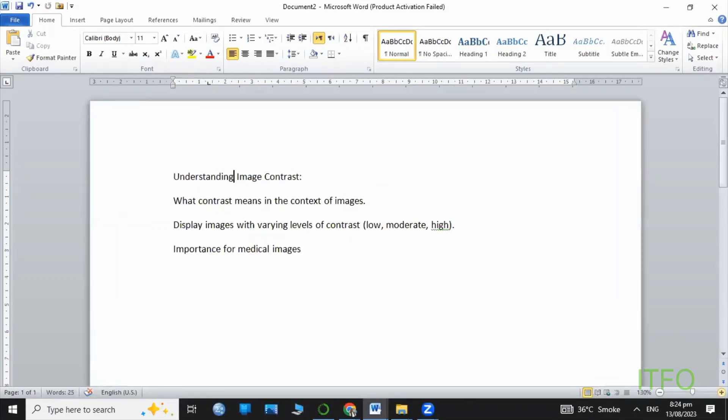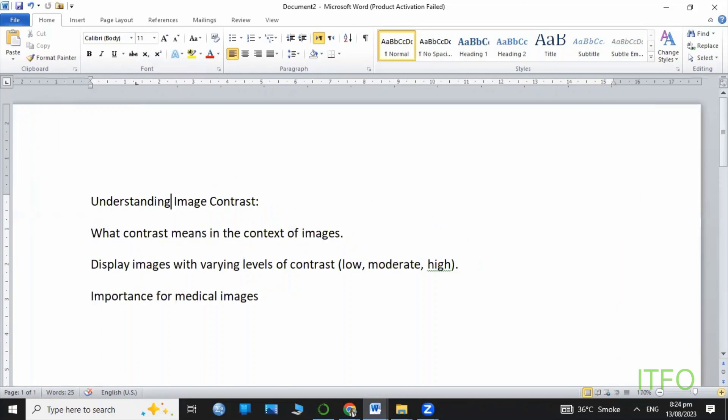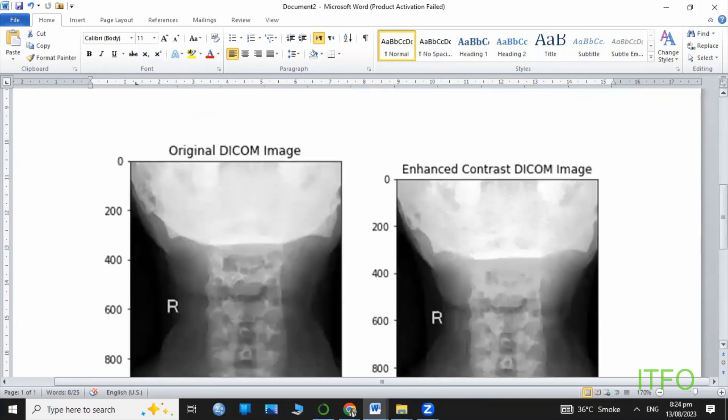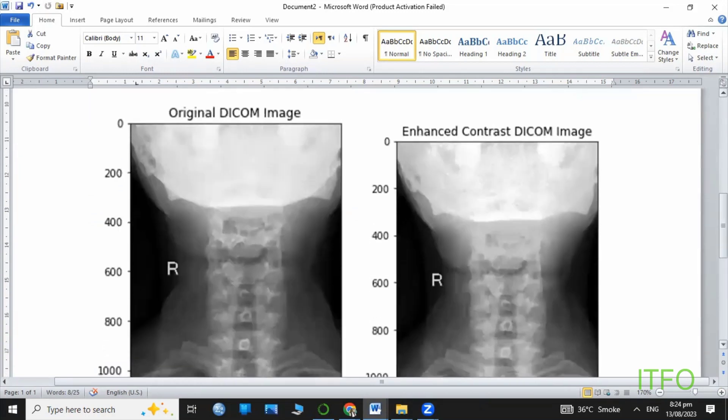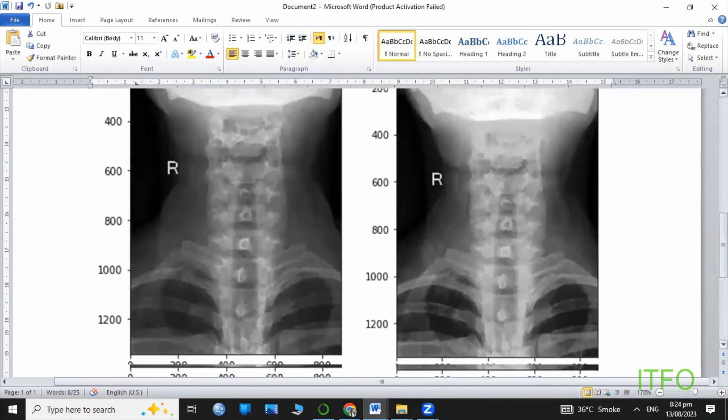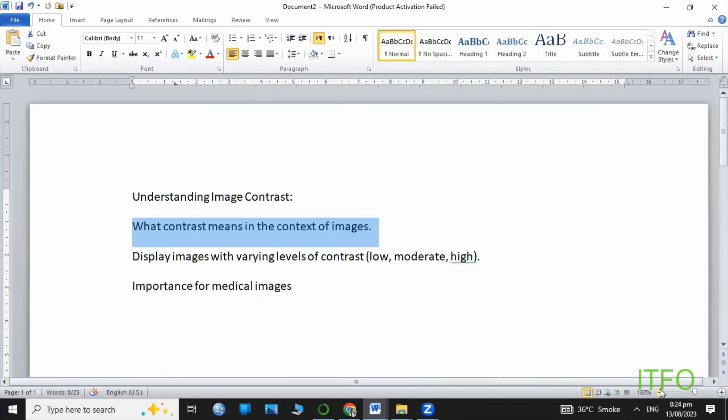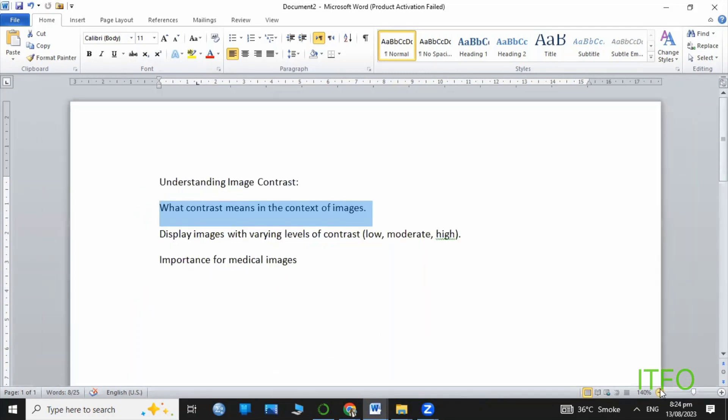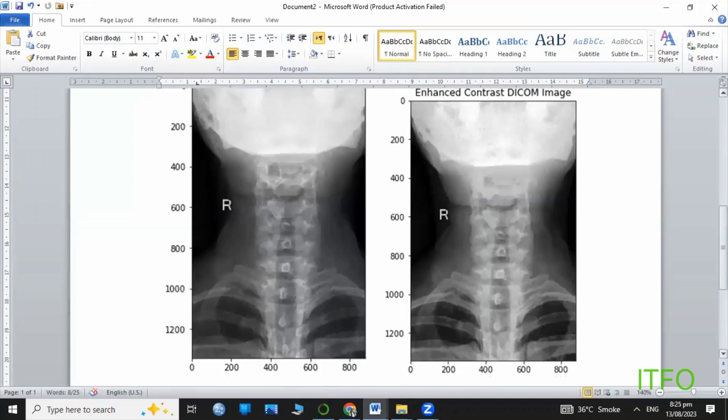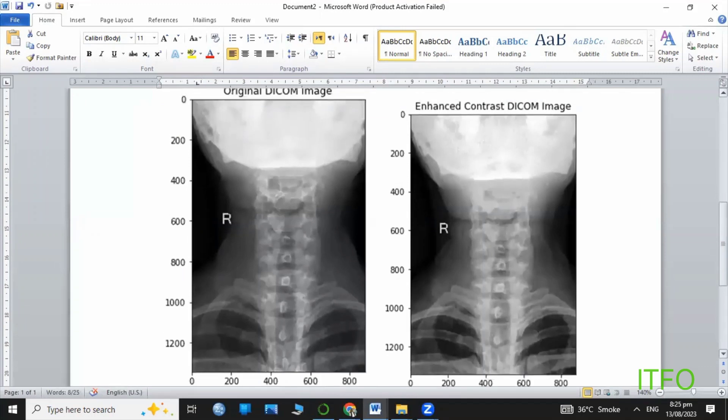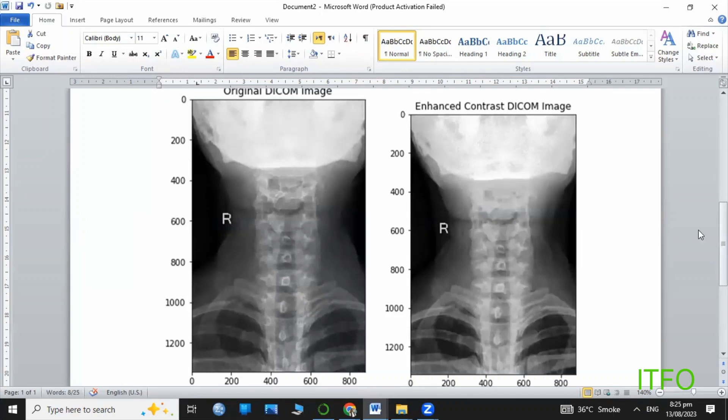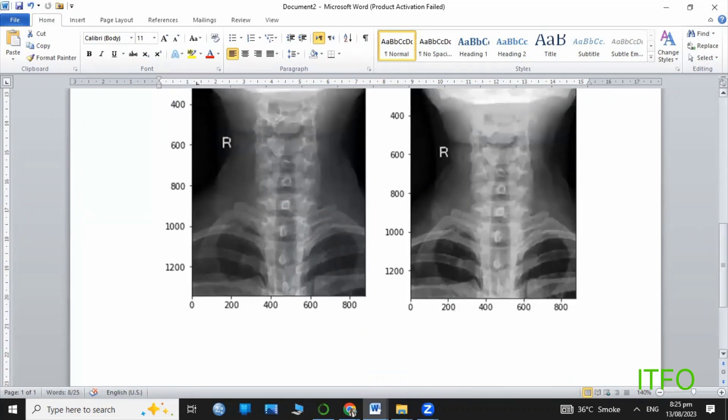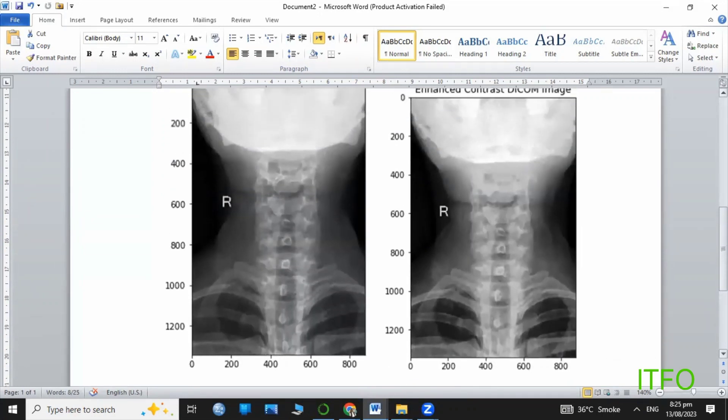Before going into detail, let's understand what contrast means in the context of images. There are various levels of contrast from low, moderate, to high. You can increase the image lightening effects, or the black spots or white spots. You can visualize more of these effects.